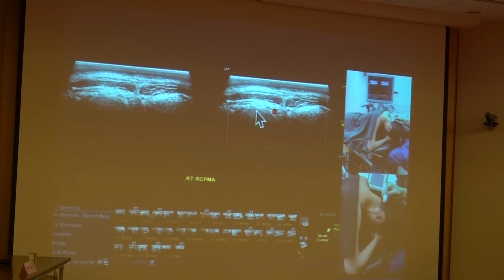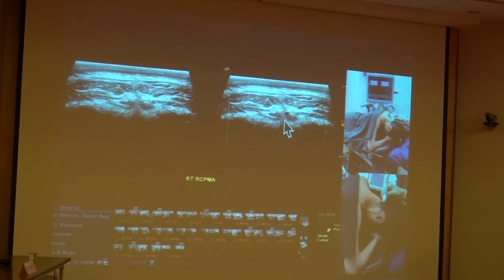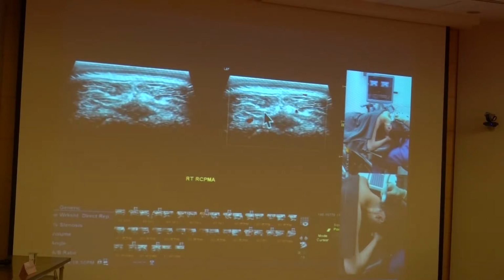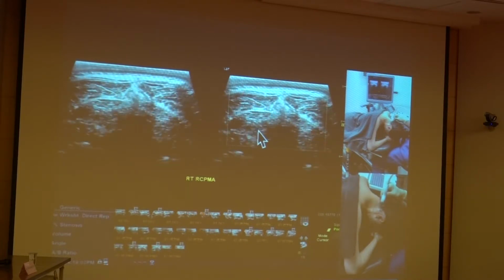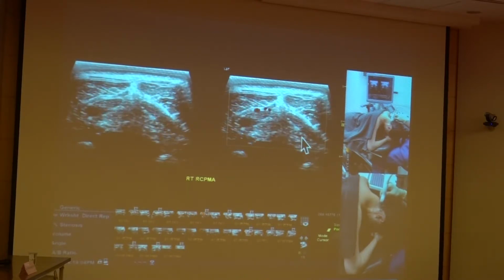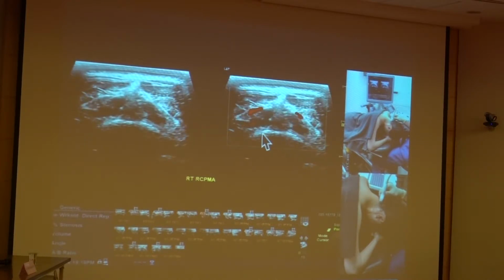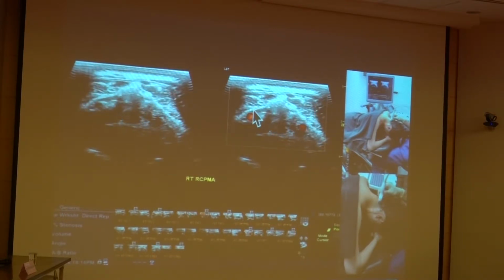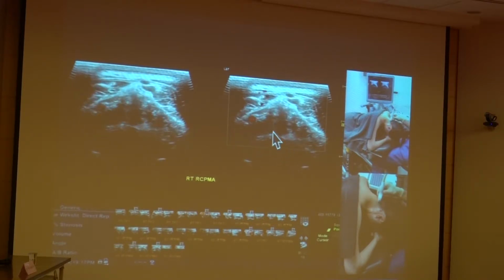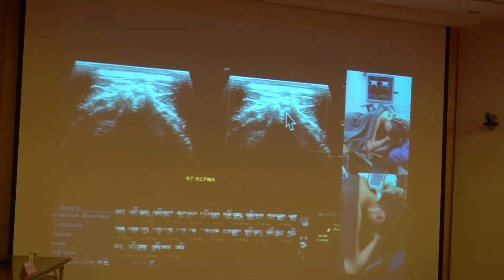Semispinalis capitis. I'm scanning down. On the most medial side, you're seeing this is a rectus capitis posterior minor, minor, major, major. You see the C0-C1 joint with a ligament, C0-C1 ligament with joint, and also you see the posterior arch of your C1. And remember this artery is going into the brain, and you see the C1-C2 space, and it is the bifid spinous process of C2.